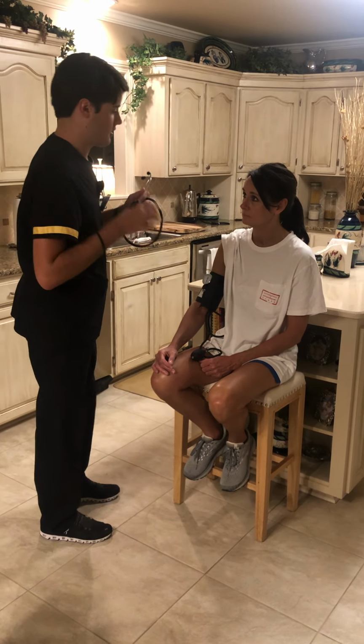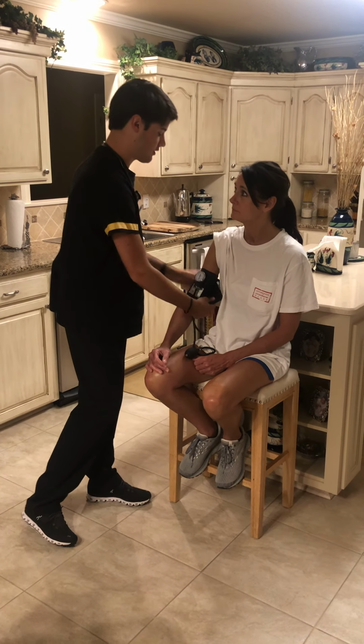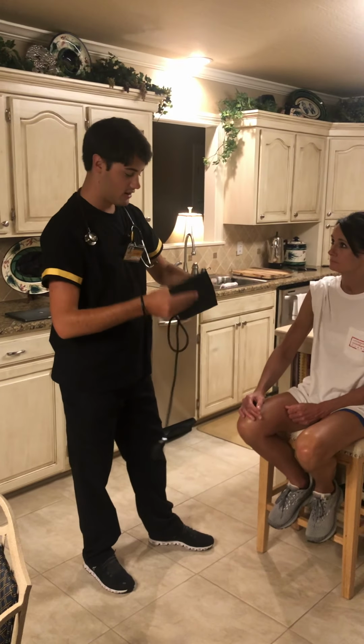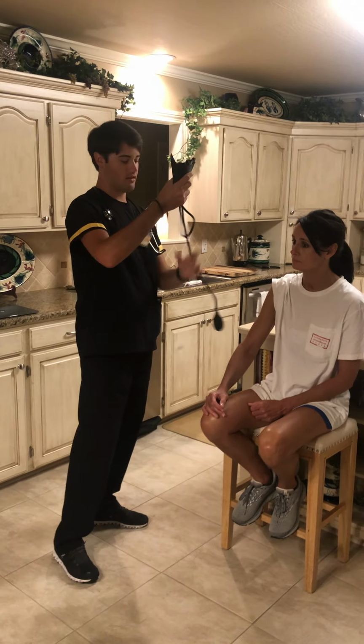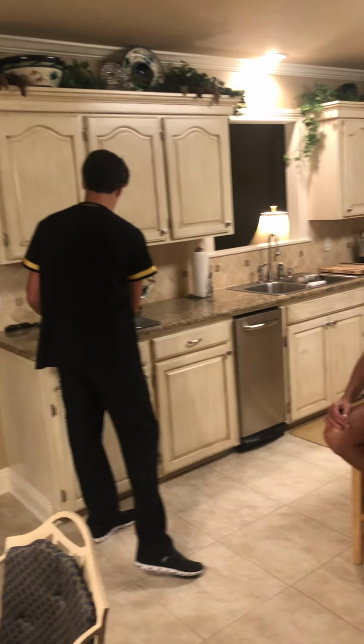The first sound was heard at 108, the last sound was heard at 60, so your blood pressure was 108/60. The normal range is 110/60 to 139/79. So your systolic was a little low, but that's okay.